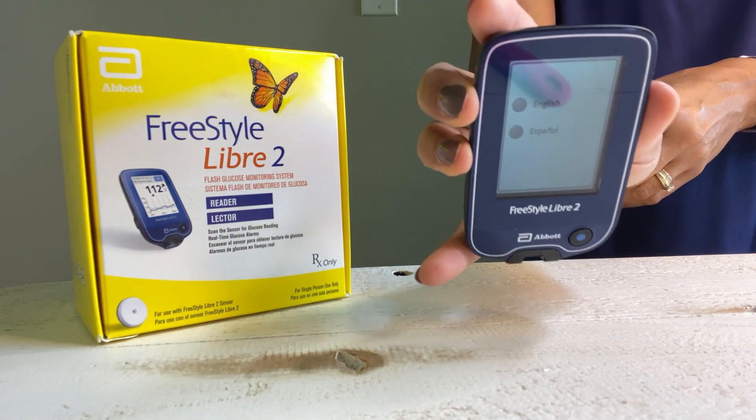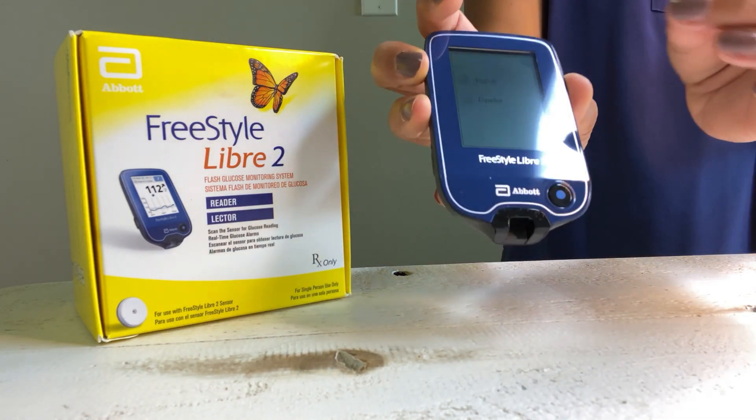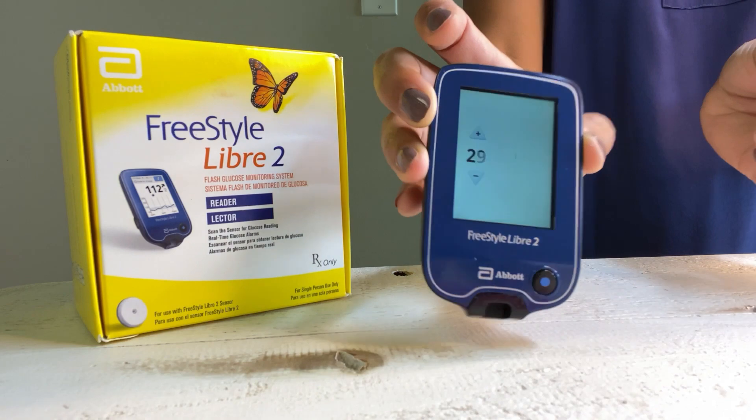It asks which language — English or Spanish. I select English. You just click the screen and click OK up in the corner.